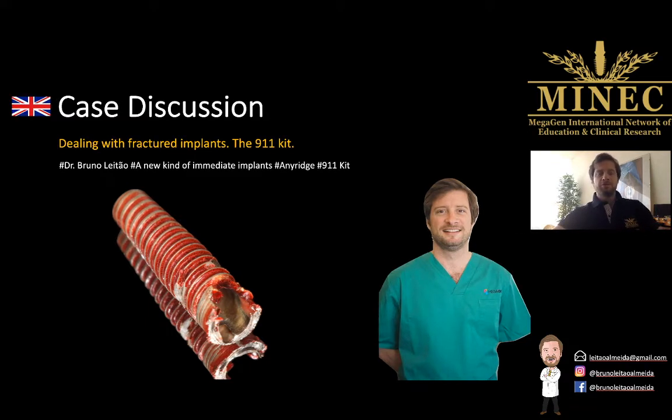And today I'd like to present to you and discuss with you how to deal with fractured implants using the 911 kit from Megagen. This is a problem that we get in our office. Thank God it's a rare problem, but the truth is it happens, and it can be really difficult to deal with. Because if you get this kind of fracture that you see here in this image, there is really no other option but to remove the implant. And it can be quite tricky to approach this situation in a private clinical setting when the patient does not understand that this is the only option we have.